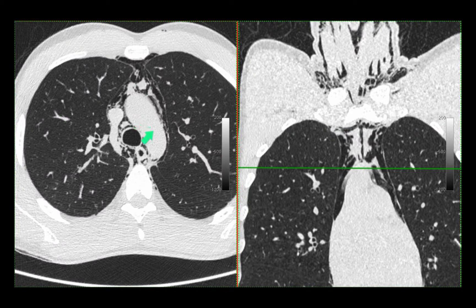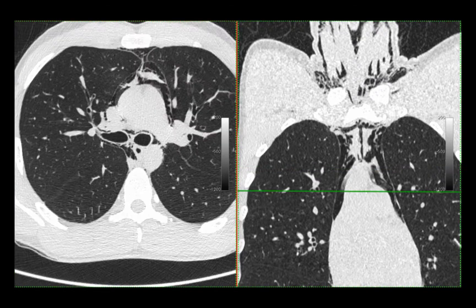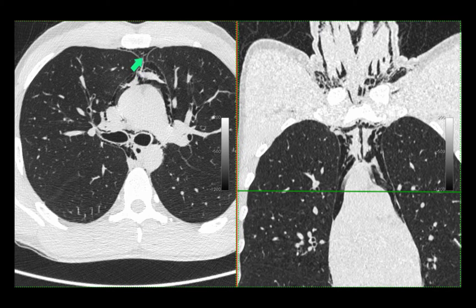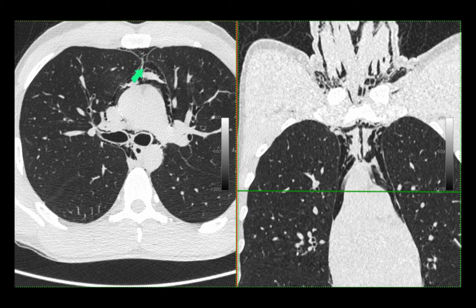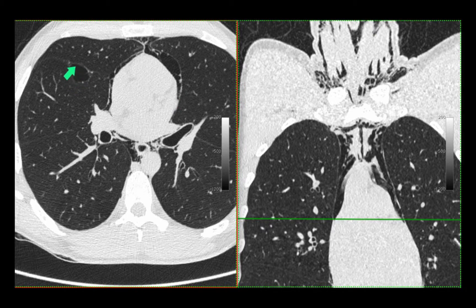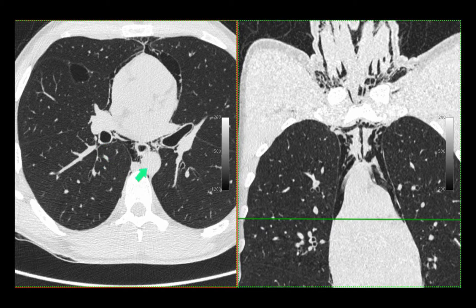Here is the arch of the aorta. Here is the azygous vein joining the SVC. You can nicely see gas around the left main bronchus and anterior to the carina. You can also see the anterior junction line being delineated by gas, and gas also tracks around the heart. You can see a little collection of gas in the minor fissure on the right-hand side. Here is the oesophagus outlined by gas in the mediastinum, and this is the bronchus intermedius. There is the azygous vein and the descending aorta.